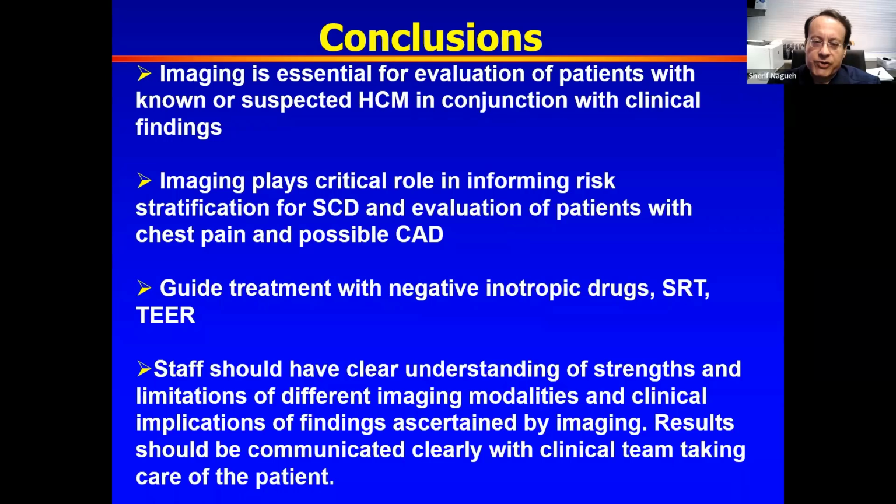Where is the best place to measure the septum in the parasternal long axis to distinguish between elderly sigmoid septum versus true hypertrophic cardiomyopathy, to avoid overmeasurement? So it's not just where you measure it, but it's also how you measure it. Sometimes it's the very basal 1 centimeter or so that has the increased thickness, and as you move apical to that point, the septal thickness is not increased. Here it is important, if you're looking at that echocardiogram and reporting it, to say this is the place where the septum measures that much.